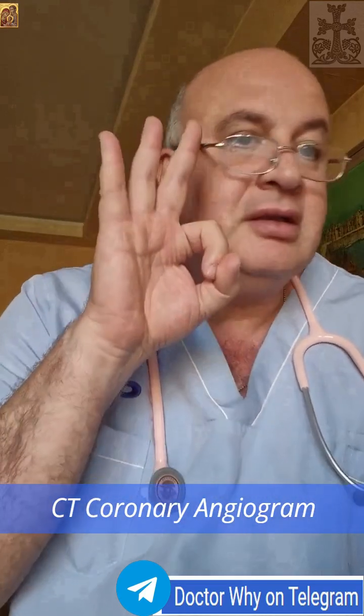So clinically, CTCA is most useful for patients with chest pain of uncertain origin, intermediate pretest probability of coronary artery disease, and exclusion of coronary artery disease in low-risk patients, where it can safely prevent unnecessary invasive procedures.